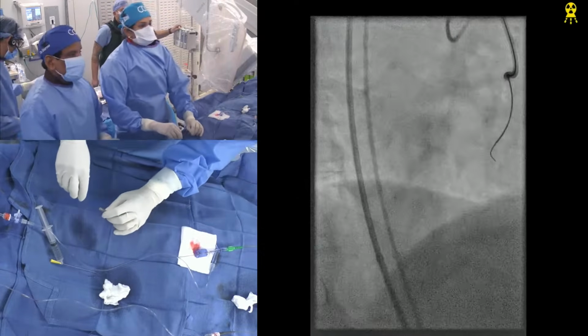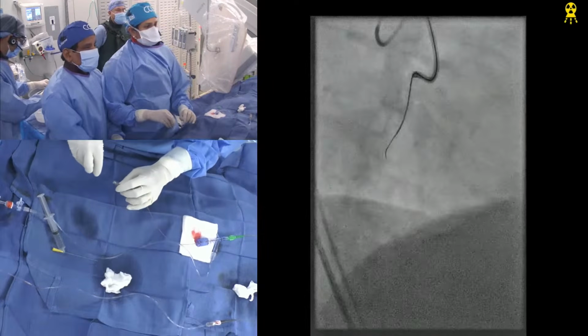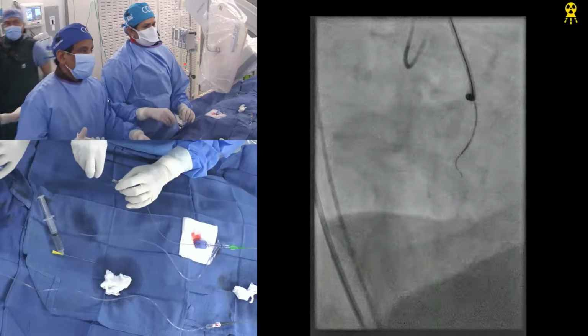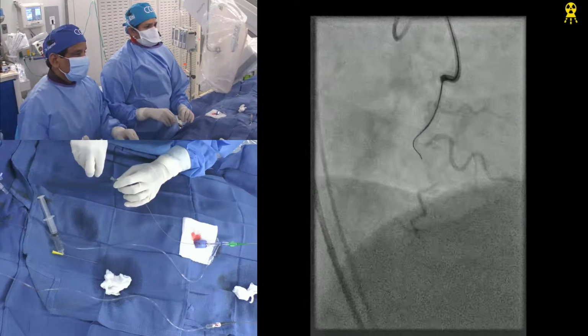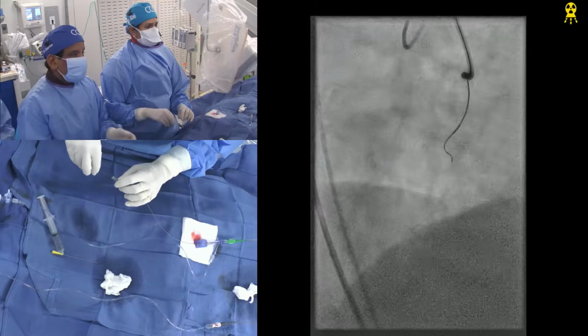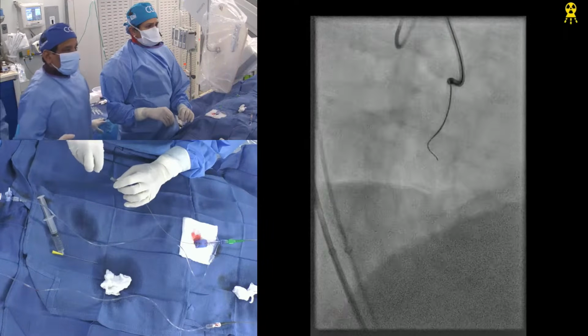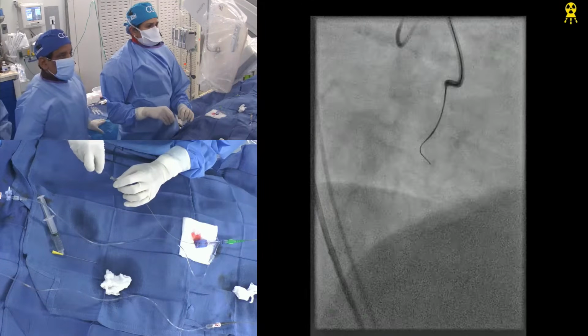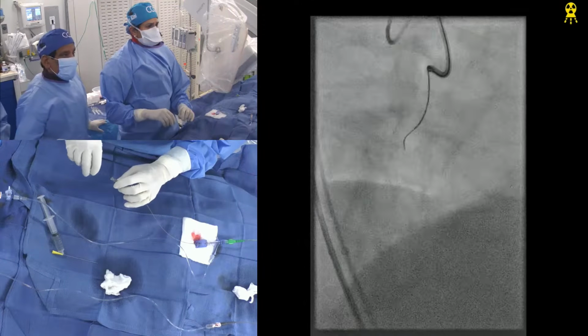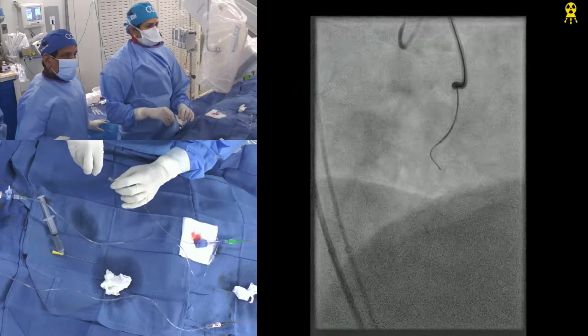See the fluoro first. Let me give you a little dye. So a large contingent of technicians led by Pawan are watching us, and mentioning that this is an excellent teaching case. We absolutely agree, and hopefully there will be many tricks to learn. Beautiful.